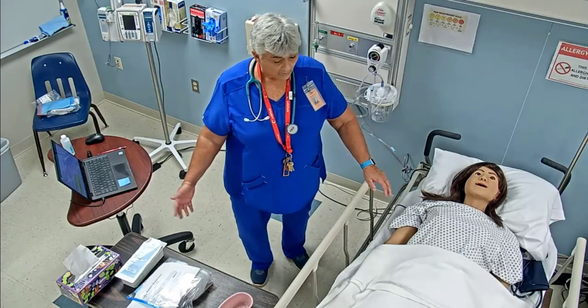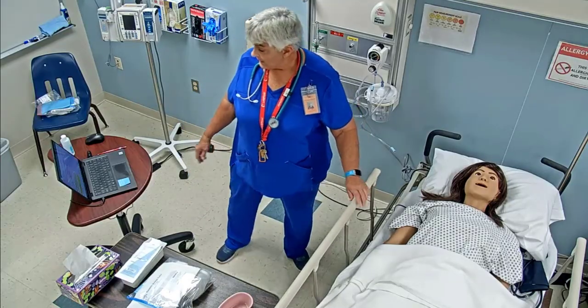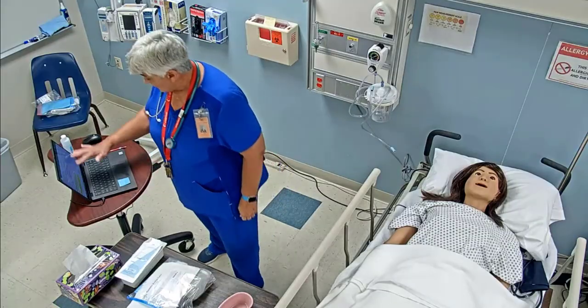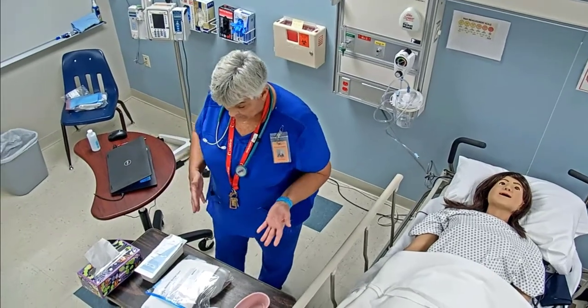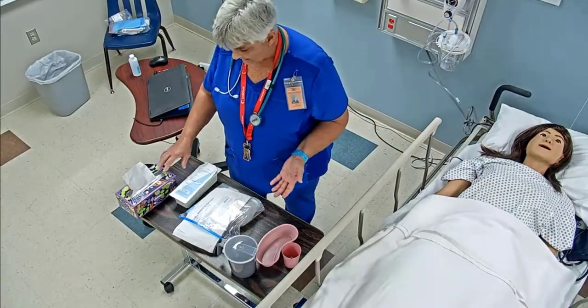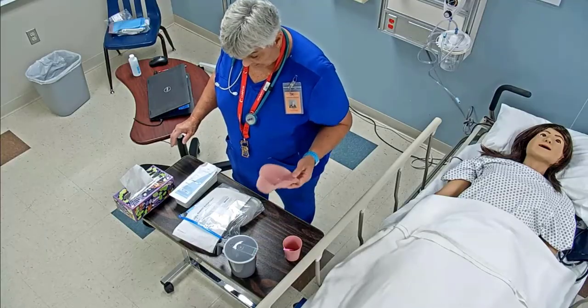With anything, we always want to make sure we have good lighting. Once we have checked doctor's orders, I'm going to go ahead and shut down my computer for HIPAA. I'm going to go to the supply room and get all my supplies. I've got some tissues. I'm going to have a cup with a straw for my patient, an Emesis basin.